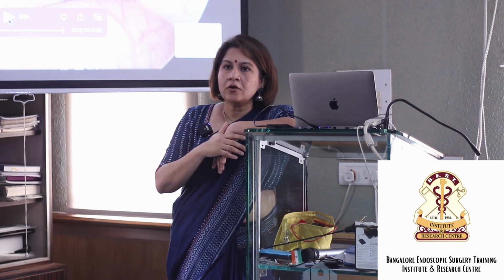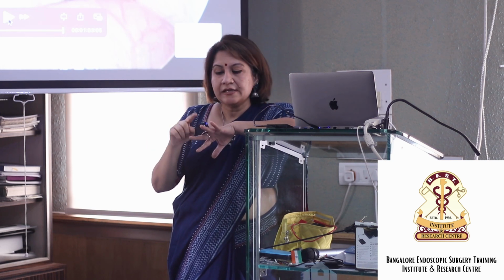So even when we are taking up a cornual block, counsel them about 3 possibilities. 1, we put the dye, the tube was open, it was a false positive. 2nd, the tube is blocked, we are able to cannulate. 3rd, the tube is so badly damaged, we are not able to cannulate. So counsel them beforehand, these are the 3 possibilities.